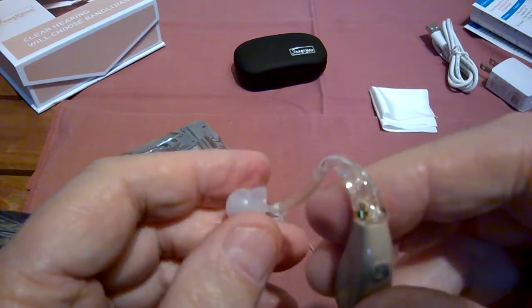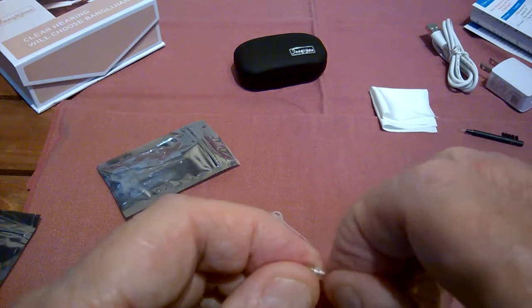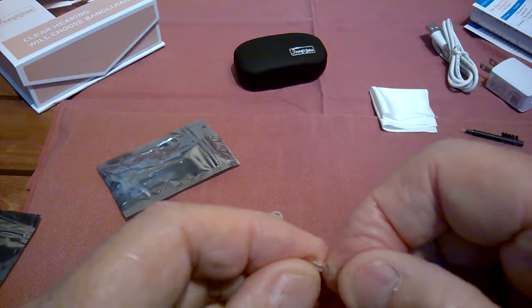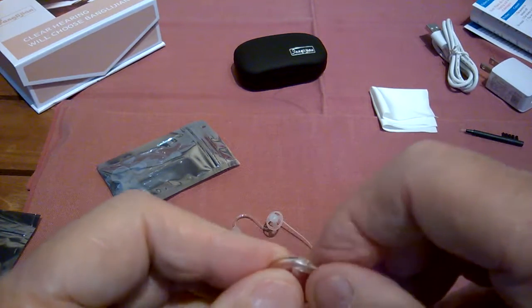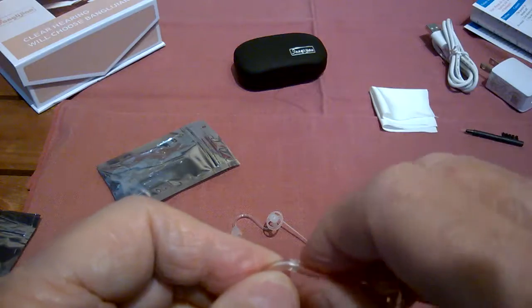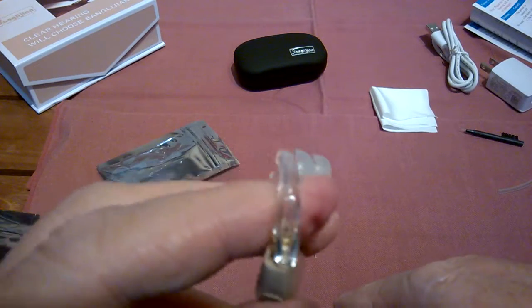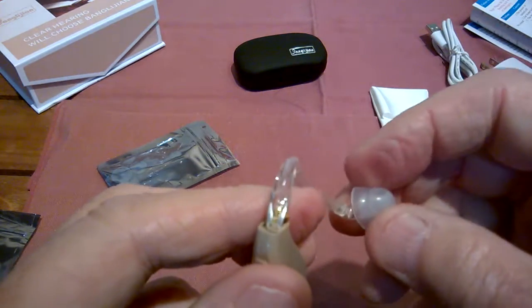This is for the right ear. Let me turn it around and show you. This would be for the left ear. Turn it around 180 degrees. Again, I apologize. This is hard to see through the camera. But anyway, now it's turned for the left. And this again goes behind your ear. Then this goes in your ear.